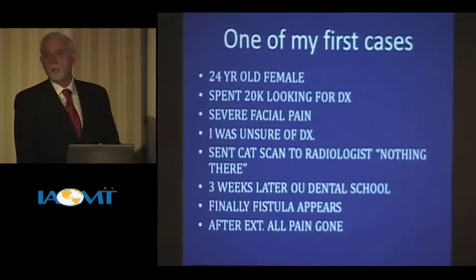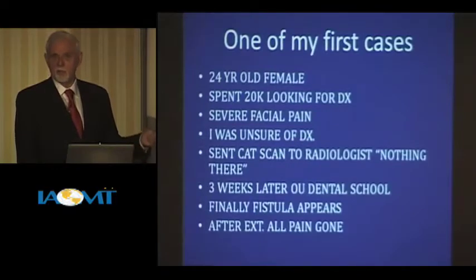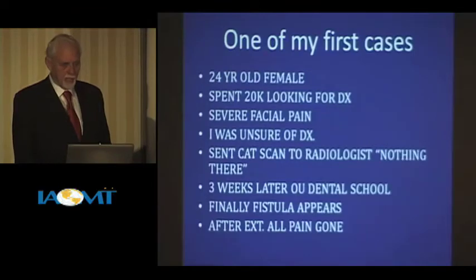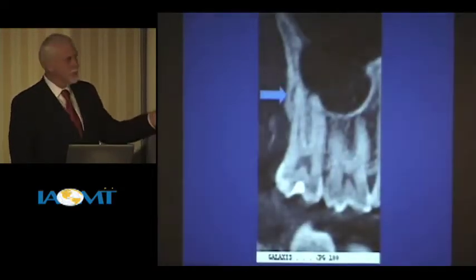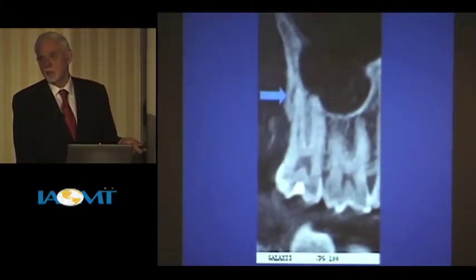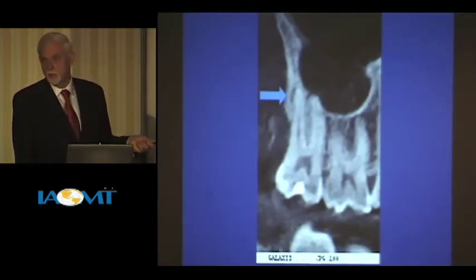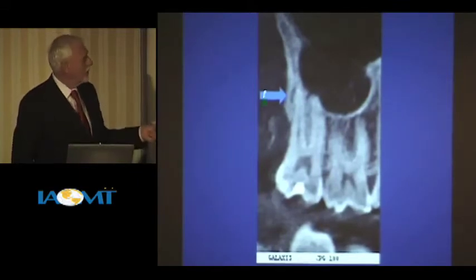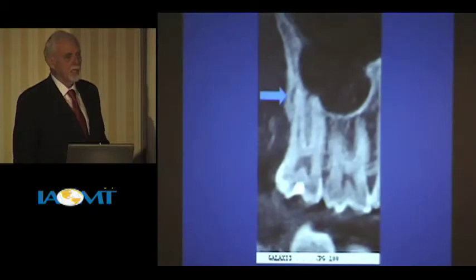So my patients have 3 choices with an infection. You can do nothing, you can have a root canal done the first time or the second time, or you can have it extracted. She elected to have that second molar extracted. This is that tooth, and nothing shows up on digital x-rays or PA. This is the lesion. That's not a big lesion. When I first saw it, I thought, that can't be normal. That's a lesion. But, you know, the radiologist said, oh no, that's okay.